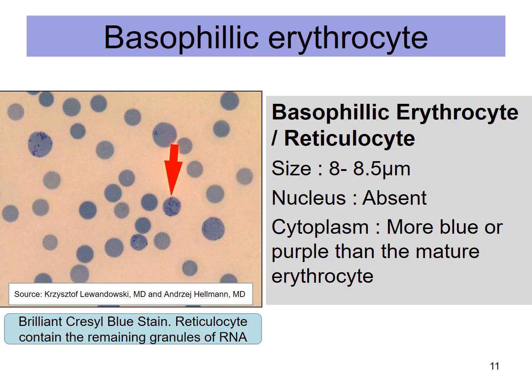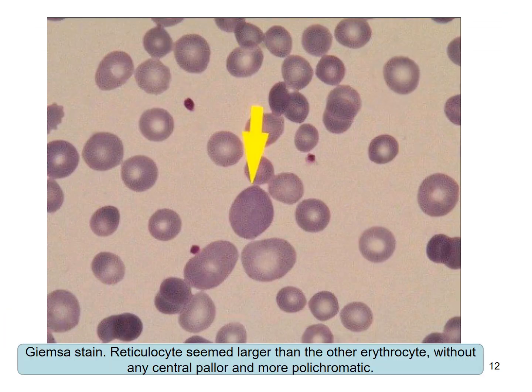Next is the basophilic erythrocyte, or what we usually call the reticulocyte. It has no nucleus and the cytoplasm is blue or purple. In Giemsa stain, the reticulocyte appears larger than the other erythrocytes, without any central pallor, and is more polychromatic.